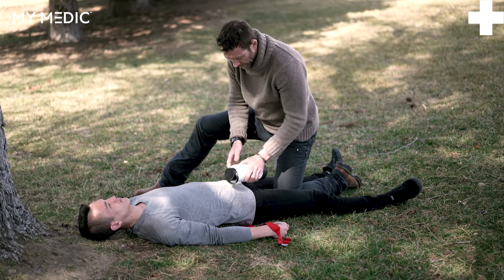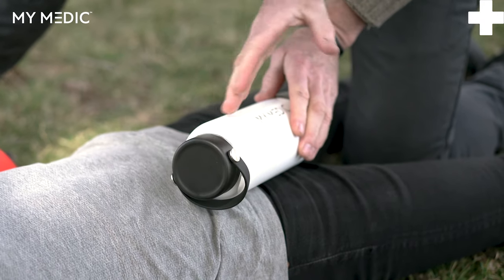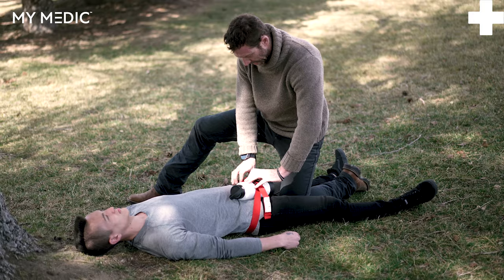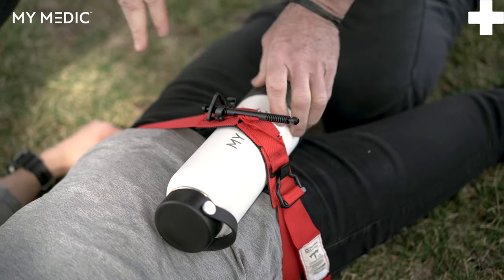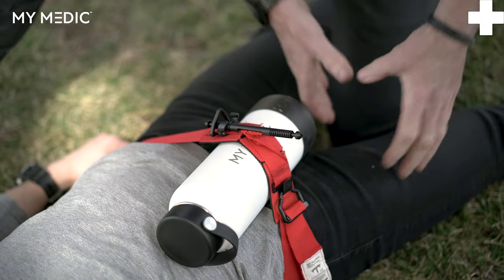Grab your rigid water bottle and lay it at about a 45-degree angle where the leg connects to the torso. Buckle your tourniquet and pull the slack out. Tighten down the windlass as you normally would until the bleeding stops. Make sure to secure it, and now you've effectively stopped that life-threatening bleed that you couldn't get to with a tourniquet on the limb.